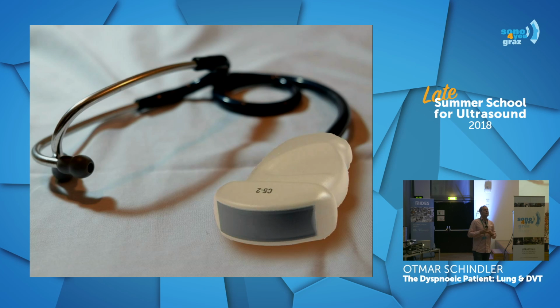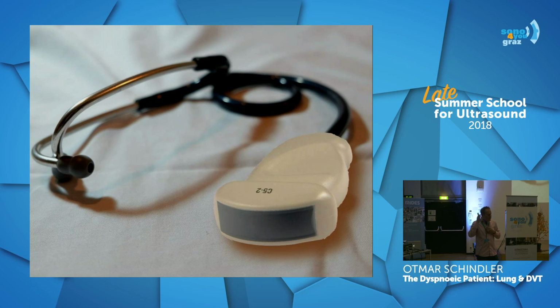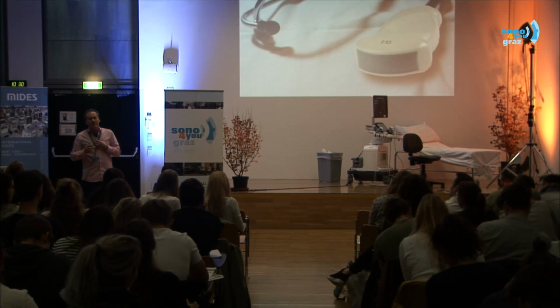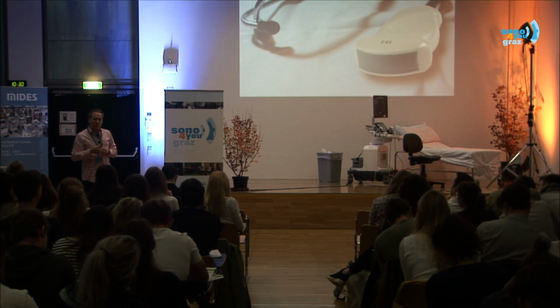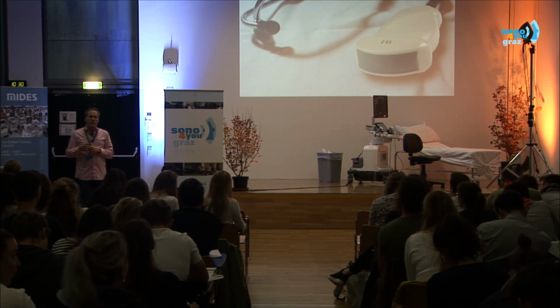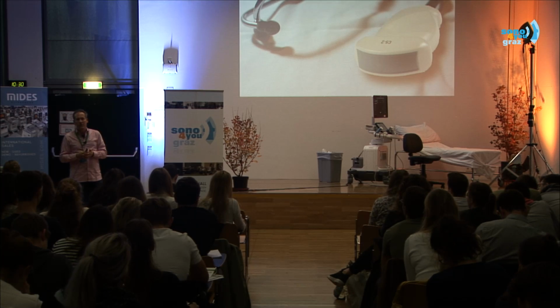If there's a thrombosis, do I have to worry about pressing on it? The question was, if there's a thrombosis, does the examiner have to worry when pressing on it? There has been some interesting work on it. There's no evidence that pulmonary embolism was caused by the compression ultrasound. So usually we don't have to worry. As soon as you see something, you can stop pressing, but you don't have to worry about it.